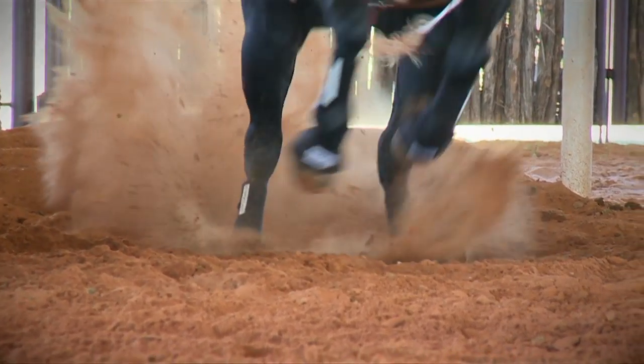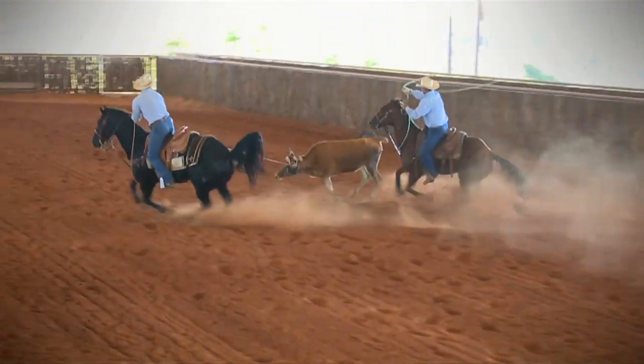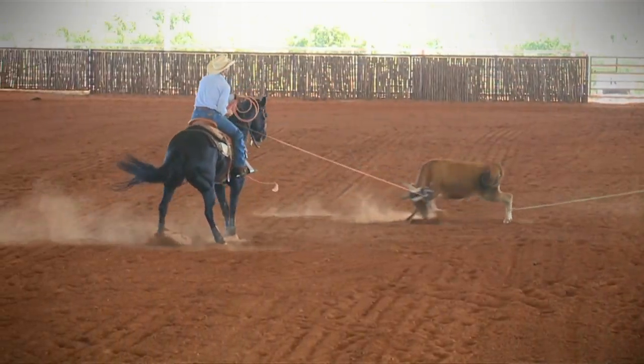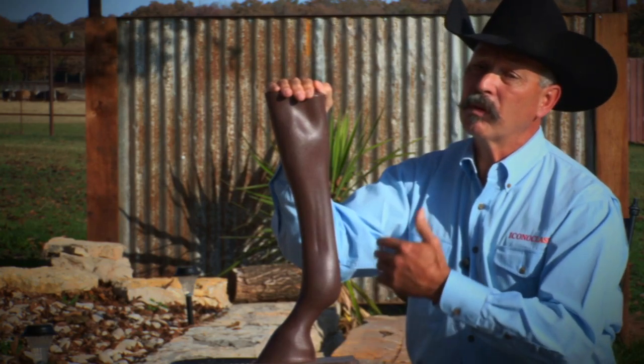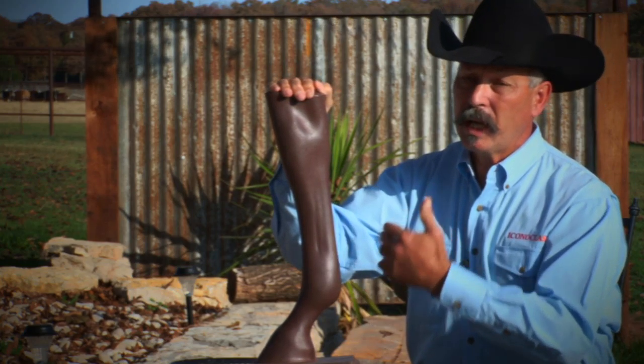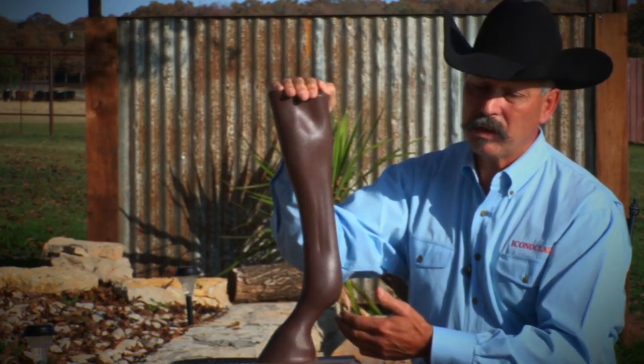What it really boils down to is that I want people to understand that the Iconoclast boot actually has a purpose and a job to do as it's attached to the horse's leg. With every function and every movement, it's providing support and protection from extensive injury to the soft tissue. If you have any questions or concerns, feel free to contact us at westernlegacysales.com. We always look forward to hearing from you. Thank you.